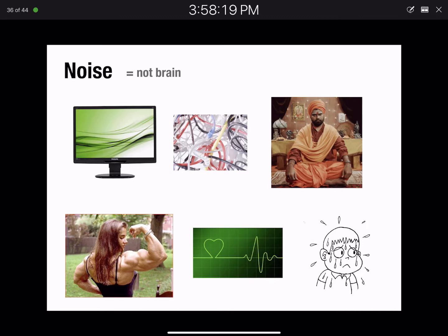So if you take all of this together, the ideal situation for recording EEG is, ideally, like some forest where the person's super relaxed and there's no ambient electronic noise other than your EEG system. But in practical terms, it's a room where you've minimized the amount of electrical stuff. The other nice thing is magnetic fields drop off sharply with distance. Putting your foot right on one of those power cords is going to give you a lot of noise. Moving your foot even a few inches away is going to dramatically reduce the amount of noise.